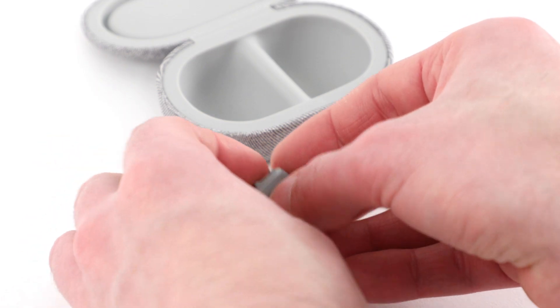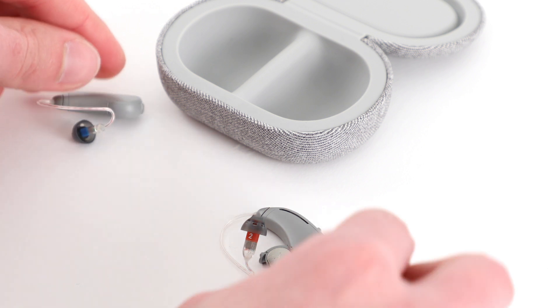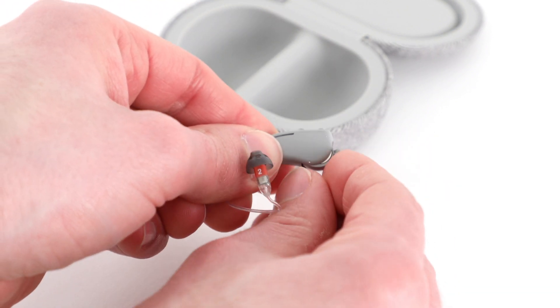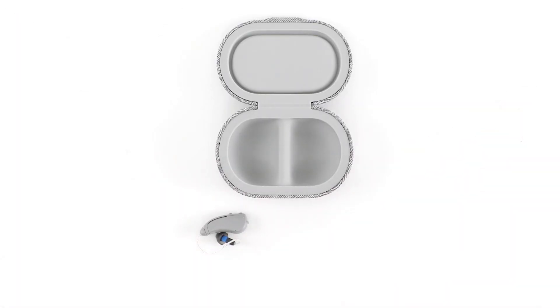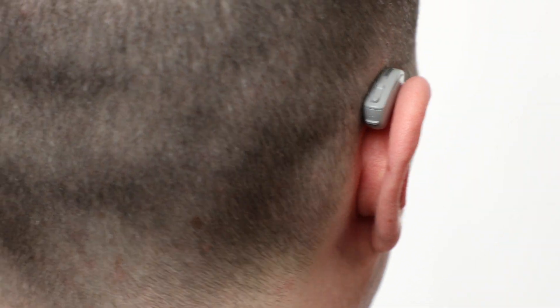Now you can fully close the battery door. You should feel two clicks, and after a 10-second delay, the hearing aid will power on. This delay gives you time to put the hearing aid on before the microphones turn on, which prevents them from whistling.